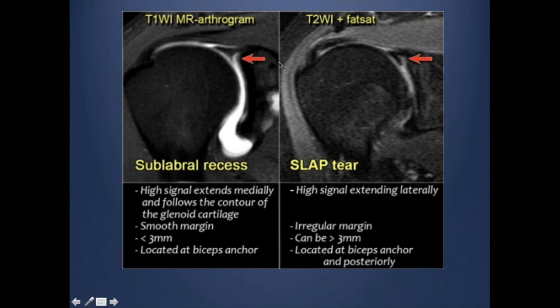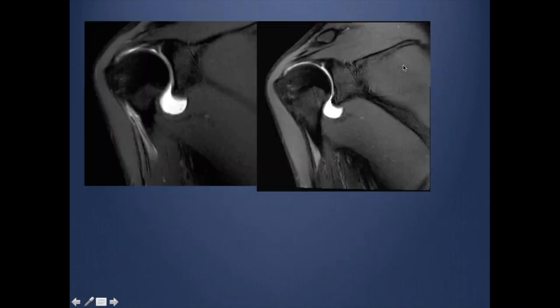The sub-labral recess is less than 3 mm, while the tear is more than 3 mm. The recess is located at the biceps anchor, while the tear is posterior to the biceps anchor. Looking at this example, there is abnormal signal with extension of contrast that goes medially, has a smooth outline and is less than 3 mm. So is this a tear or a sub-labral recess?